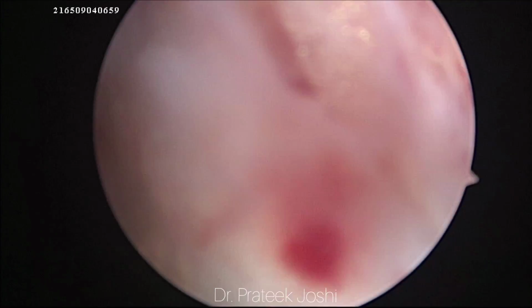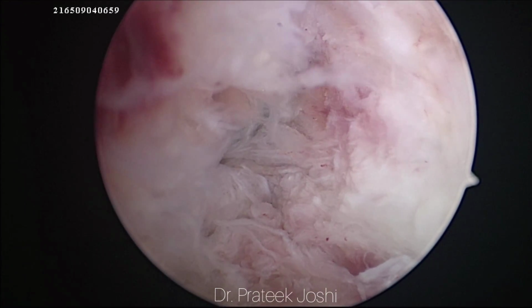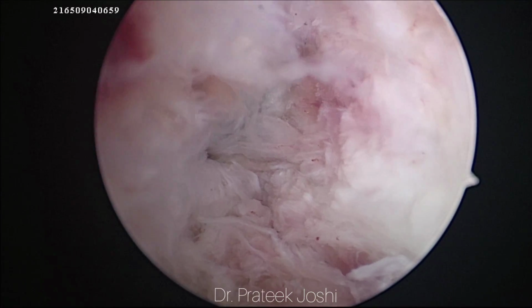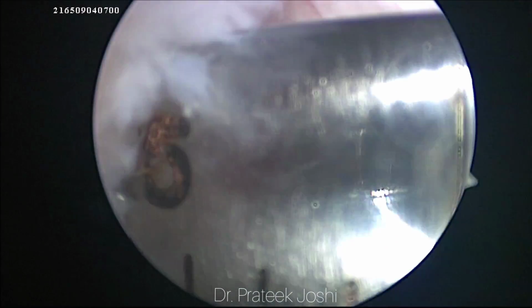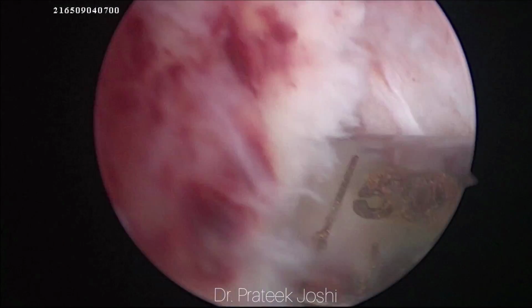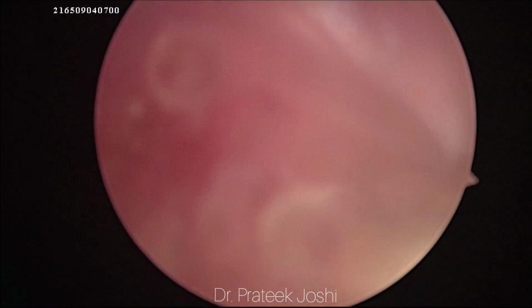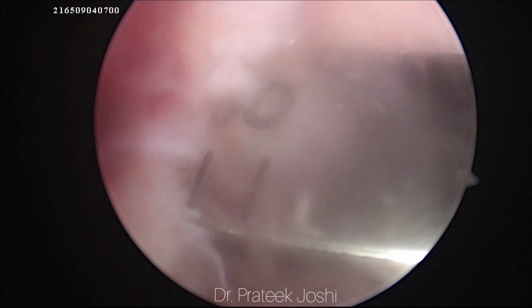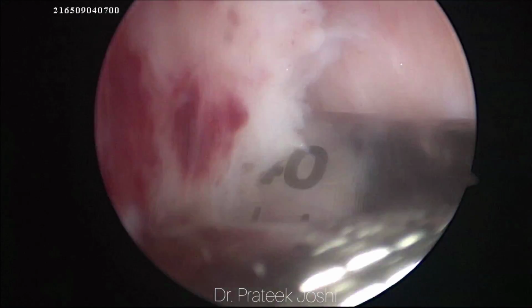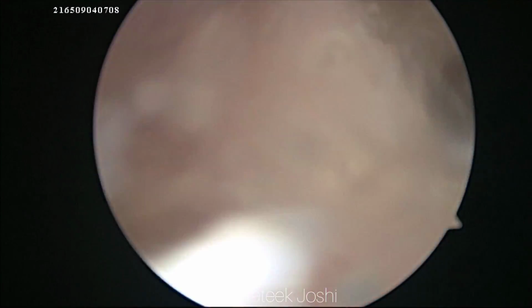So now we have completed the drilling of the lateral femoral condyle with the endobutton drill bit over the guide wire. We have removed the endobutton drill bit as well as the guide wire. Now I am going to insert the depth gauge to measure the depth of our femoral tunnel. So as you can see, the length of our femoral tunnel is 38 mm.